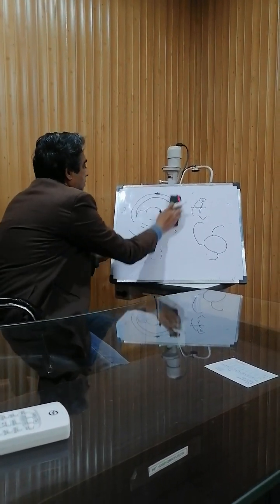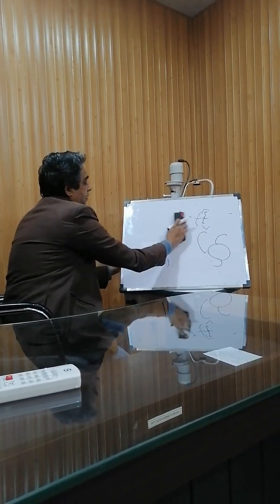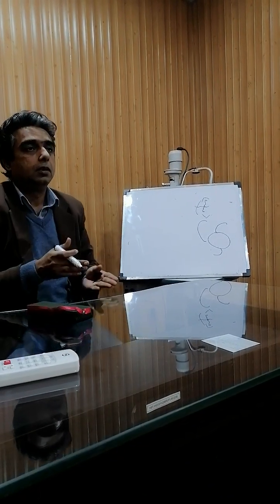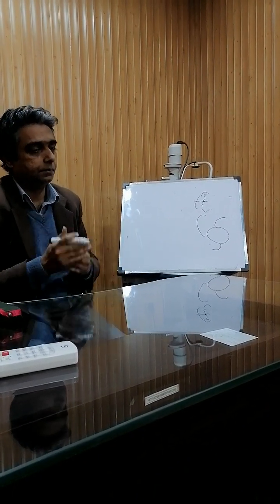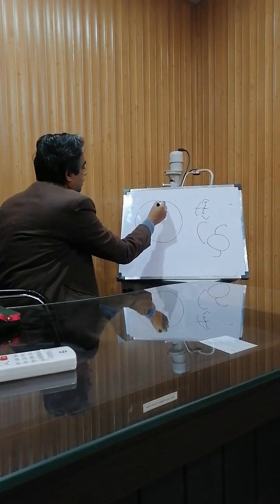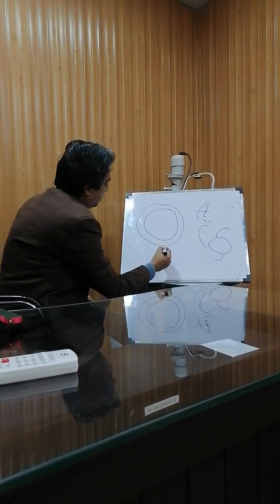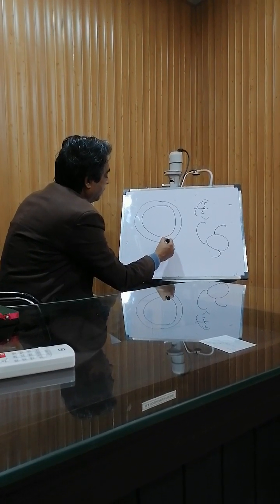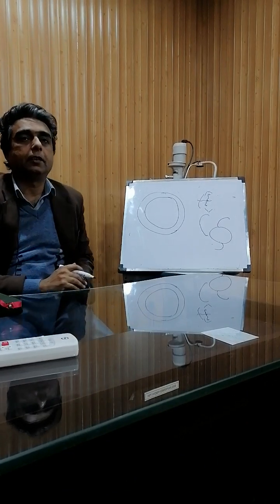So now we will learn how this extracapsular cataract extraction took the form of the surgery which is the procedure of choice now. This is the limbus. This is the dilated pupil, right? This is the 12 o'clock position, for example. This is the supratemporal position. We will give an incision at the limbus of 3.2 millimeter with a special keratome.